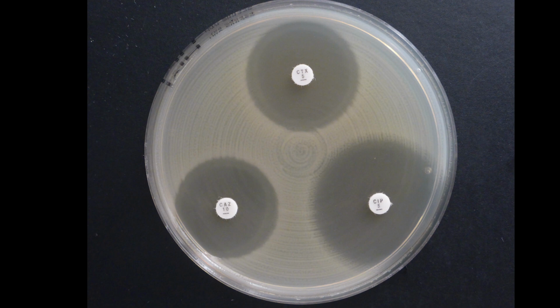And as you can see here, I have calculated the mean value and the standard deviation. When someone has read a zone that is more than 1 millimeter above the mean value, or more than 1 millimeter below the mean value, those are marked with colors here. Generally, it doesn't look so bad for cefoxitin. There are 2 people reading a little bit larger zones. For fusidic acid, we are actually very much in line and read more or less the same zone diameter. And it's just one that read a little bit smaller.